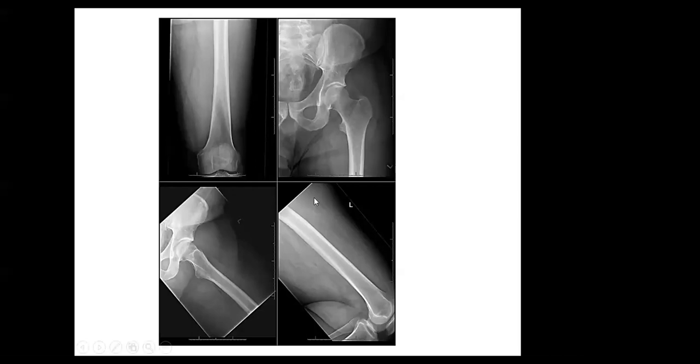Joint involvement. Lack of calcification. Why is it important on soft tissue masses and tumors that we comment on soft tissue calcification?